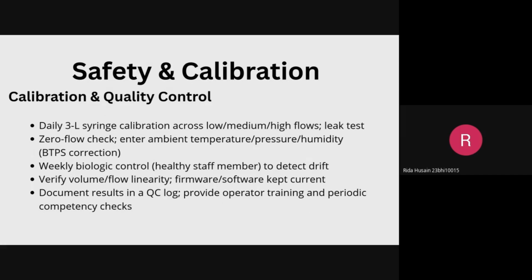Calibration and quality control: daily 3-liter syringe calibration across low, medium, and high flows, leak test, zero flow check, and enter ambient temperature, pressure, and humidity. Weekly biologic control to detect drift.